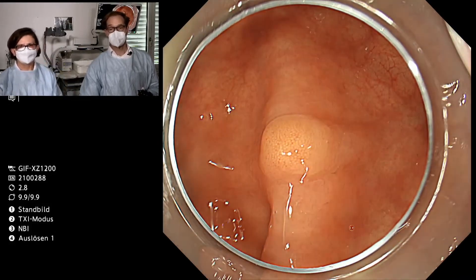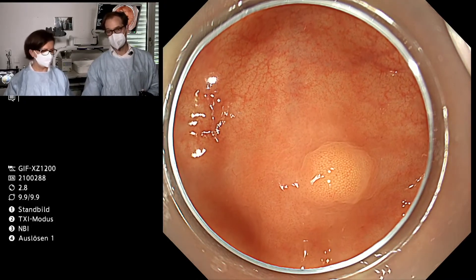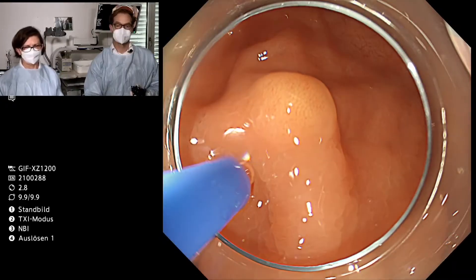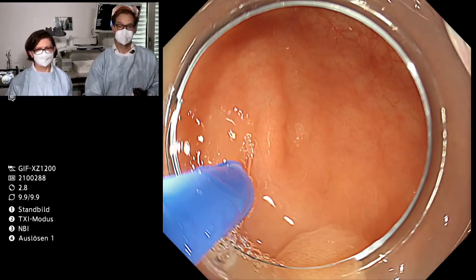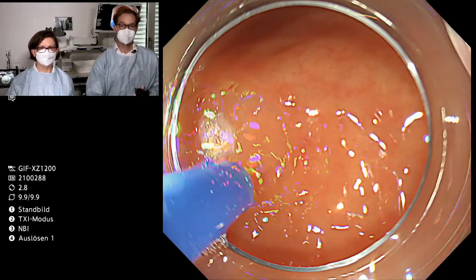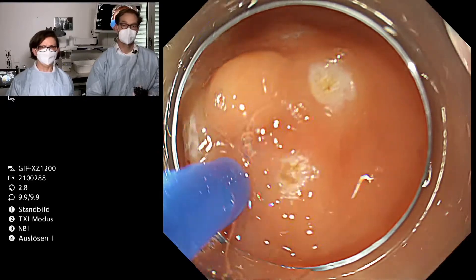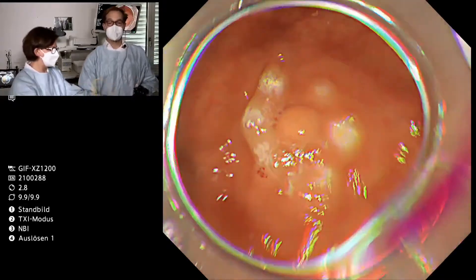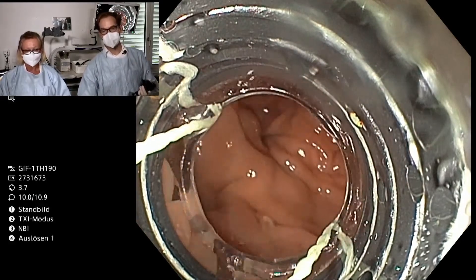That's the reason why we would like to show you the quite simple band ligation technique. For that reason we are going to mark the lesion to keep a better overview, and we take the APC probe for that. The marking is done, and now we are going to change the scope. For the resection we are taking the 1TH190 endoscope of Olympus.